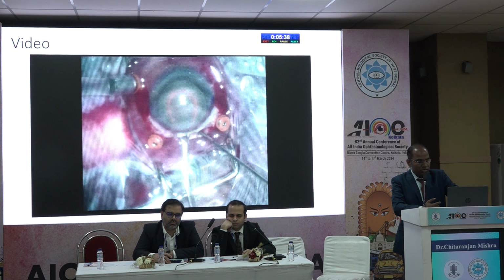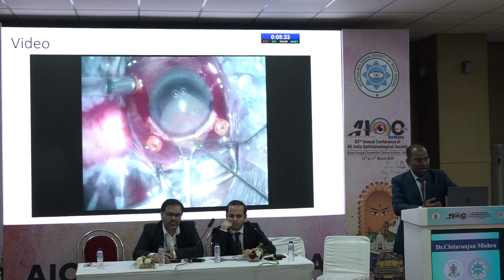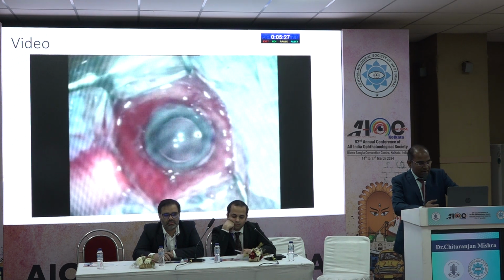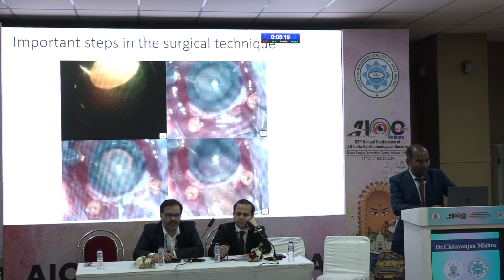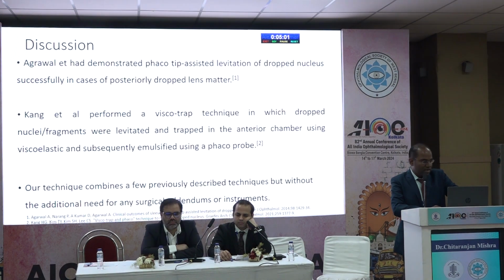Of course, visco was used for endothelial protection and with utmost respect to the iris tissue. It's just like extraction of the nucleus, what we do in SICS. Then I did a scleral fixated IOL. I do a modified Gabor's technique, no glue, no suture technique. So these are the four vital steps you can see in figure A, that is engaging the nucleus and levitating it up. Then in B you can see that it is at the pupillary plane. I am holding it over there. And in C you can see extraction is done, and at D you can see the nucleus is completely out.